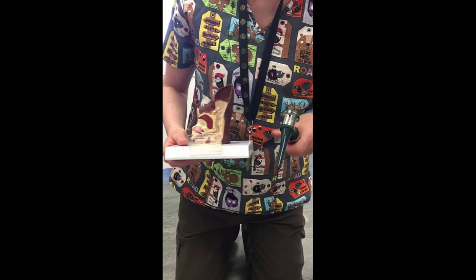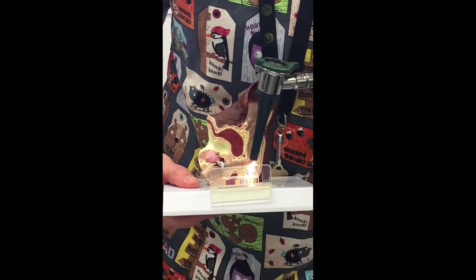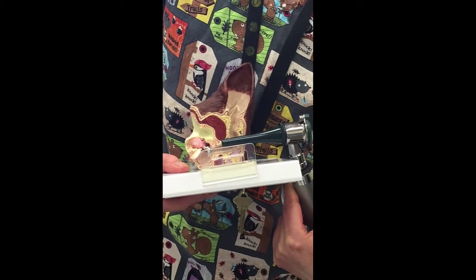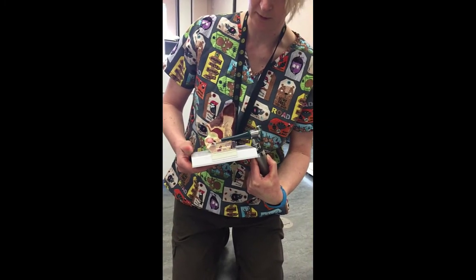So when I insert the otoscope, I'm going to go vertically down until I reach the junction, and then I need to turn it around and then point it towards the eardrum. And I'm going to demonstrate that now on my live patient.